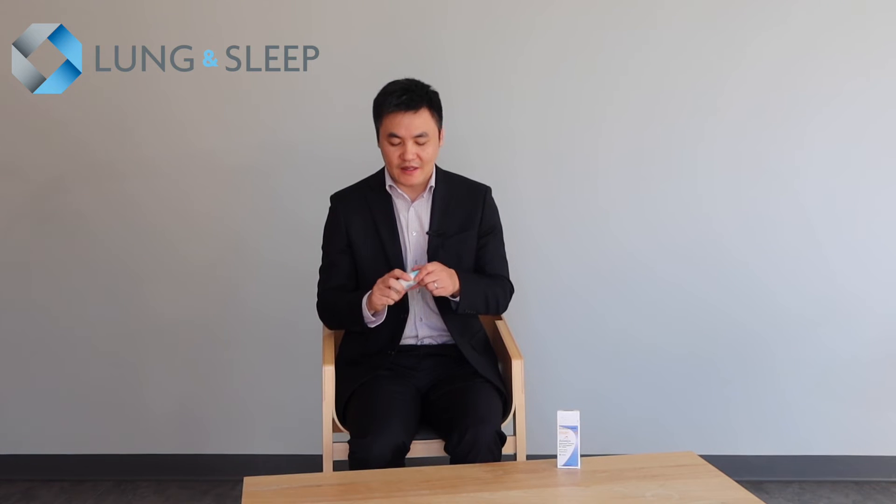The important thing first is preparation. Make sure you blow your nose to clear out any secretions or mucus, and then wash your hands. For the first time, you may need to prime the device, and that's done by shaking well, if the instructions say so, and taking the cap off.